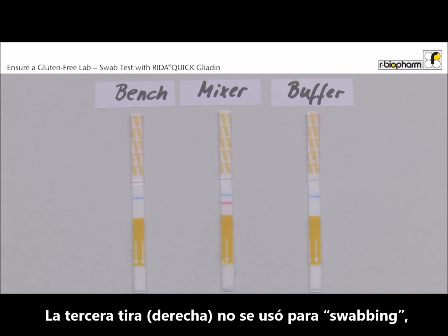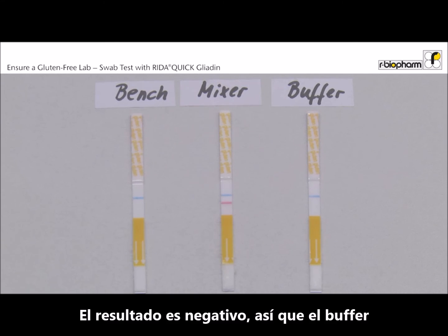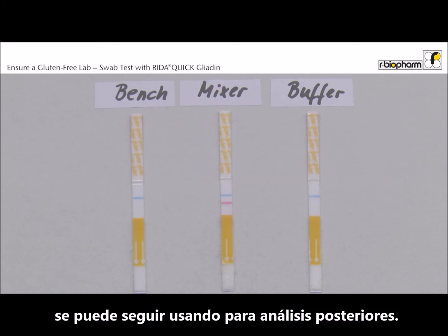The third dipstick is an unused dipstick to check whether the buffer is clean. The result is negative, so we can use the buffer for further analysis.